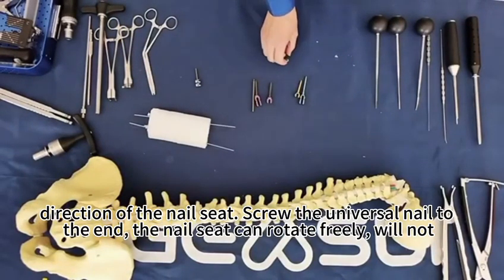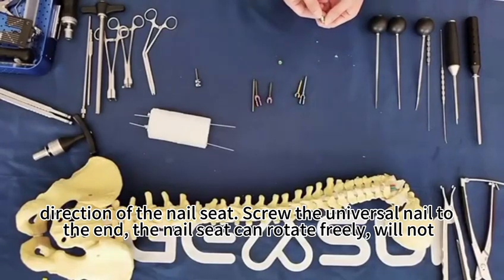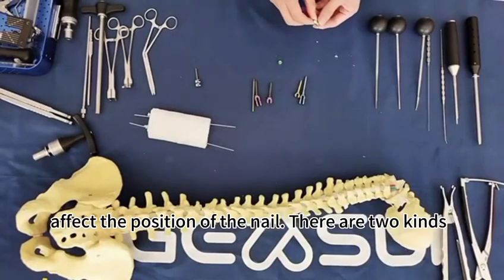Screw the universal nail to the end. The nail seat can rotate freely, and will not affect the position of the nail.